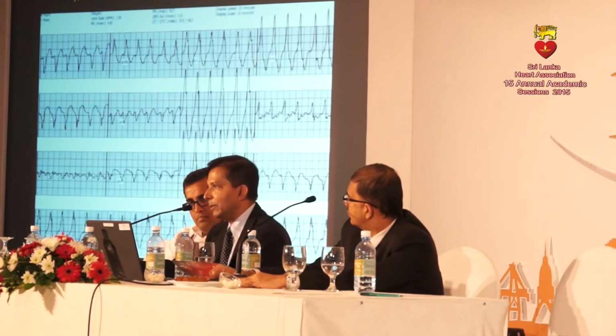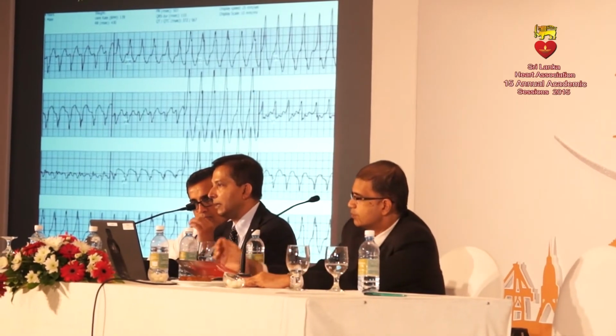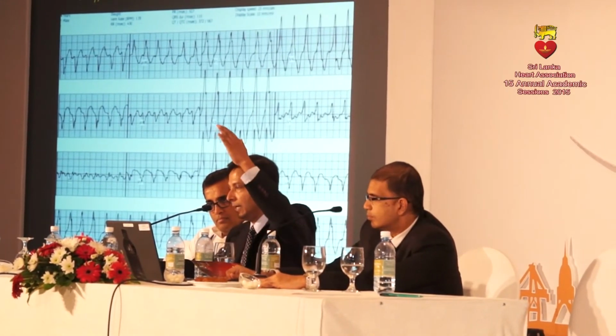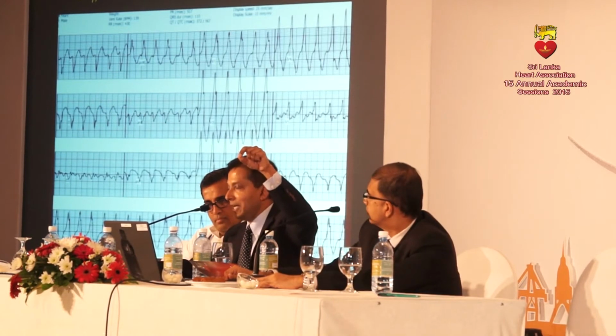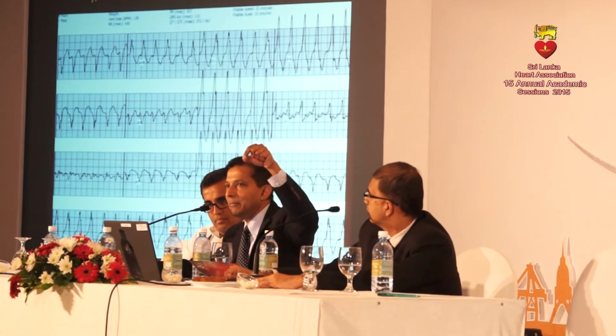Now, if I take you one more step, the problem with antidromic tachycardia is that the patient has an additional pathway in addition to the AV node, which is an accessory pathway. So it goes down the pathway, and when you go down the pathway, you enter the ventricle. It's as if you are having a ventricular tachycardia from that point. Do you get my point?